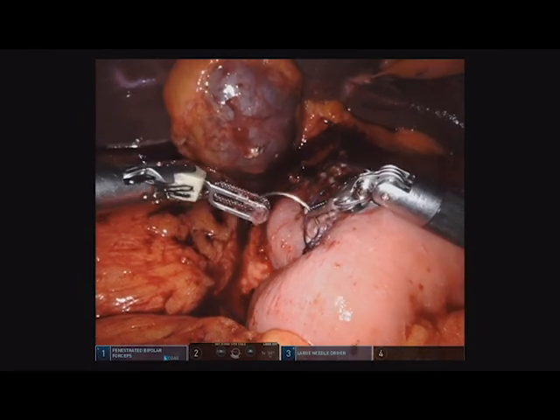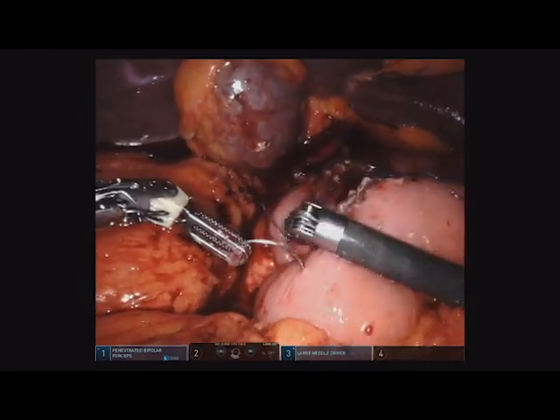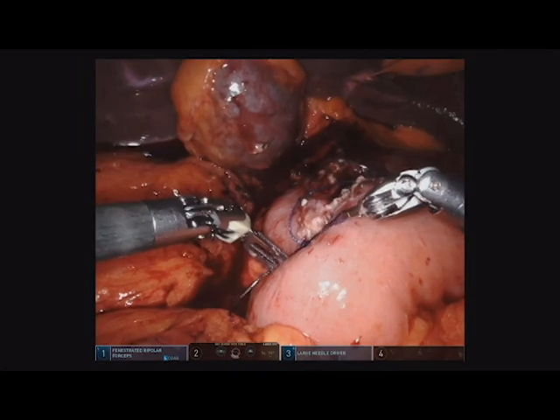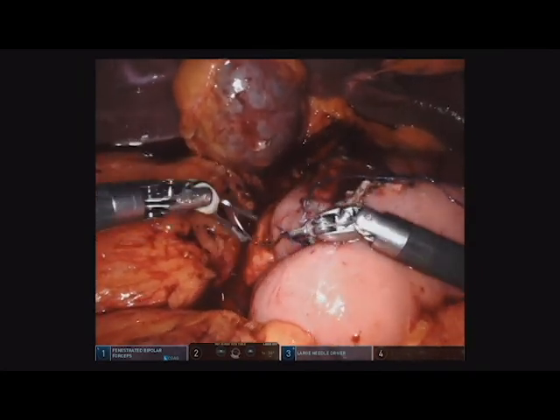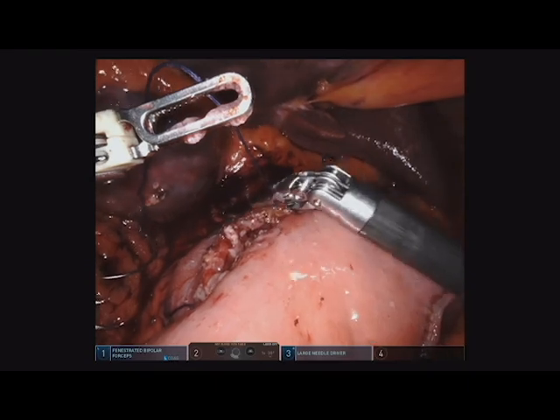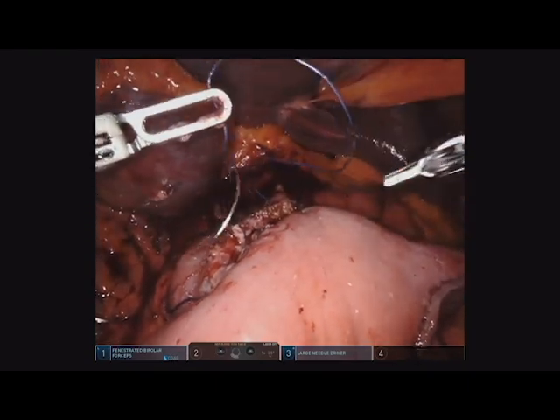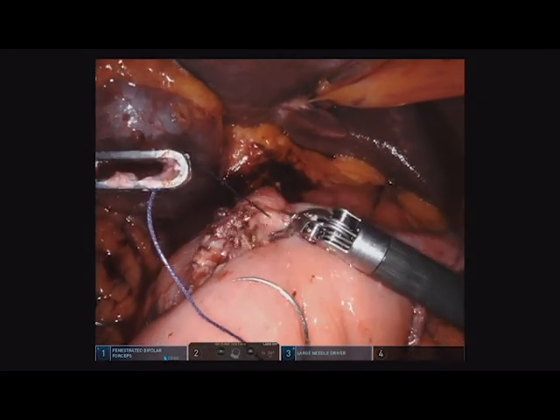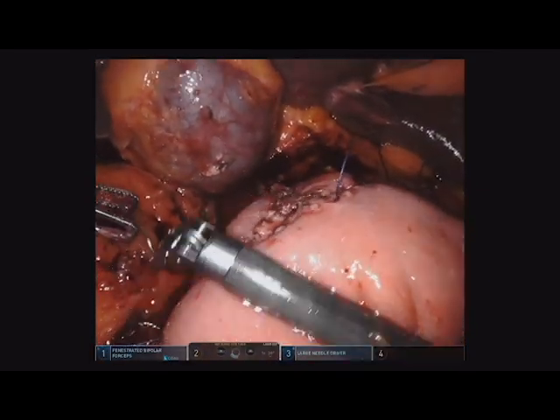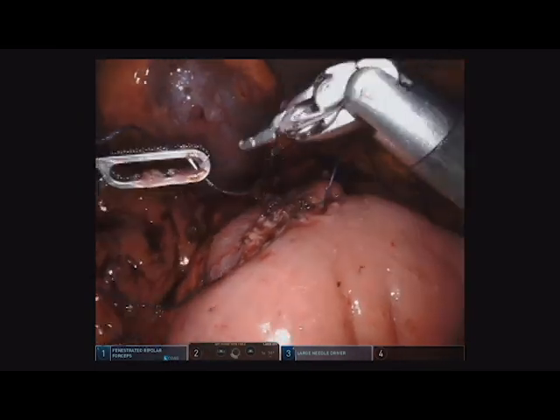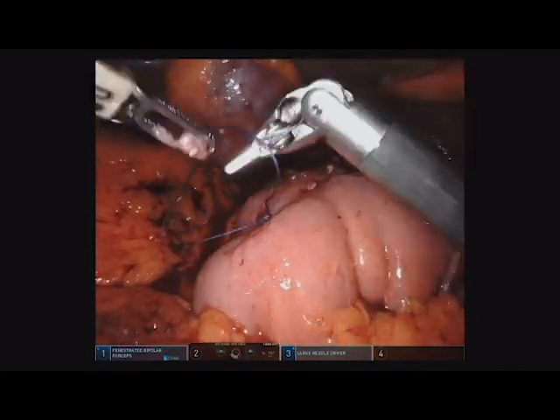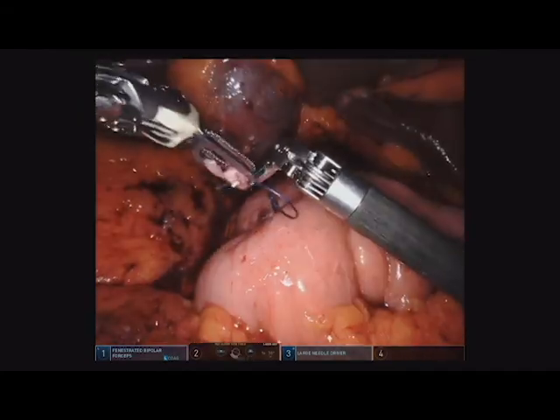Here this technique can be seen employed with the use of the robot. In order to invert the mucosa further, a Connell technique is used for another seromuscular layer, analogous to the posterior layer which set up the anastomosis. Thus, a two-layer side-to-side functional end-to-end duodenal jejunostomy is formed in the supracolic compartment.